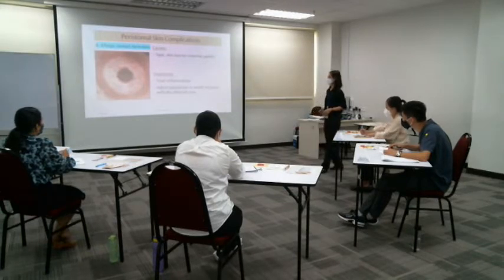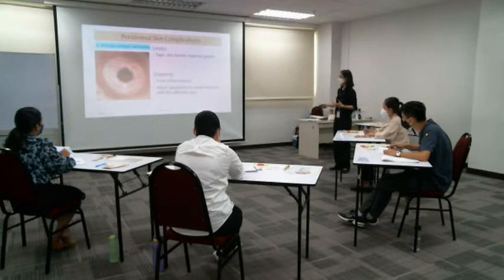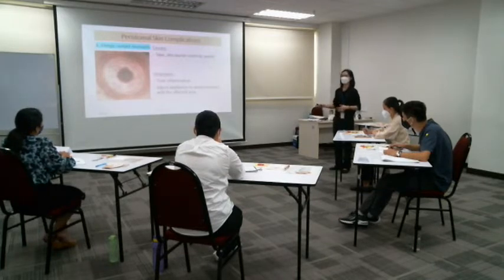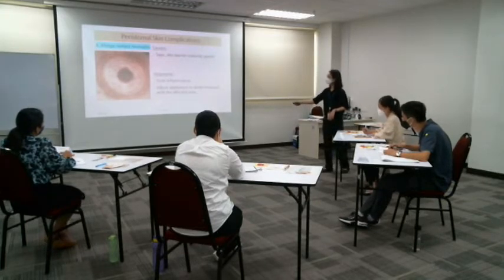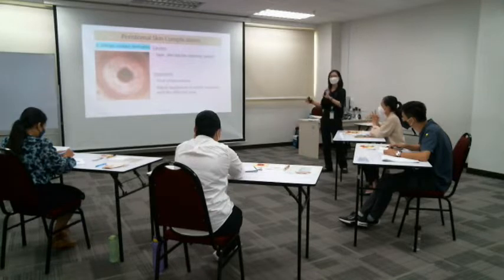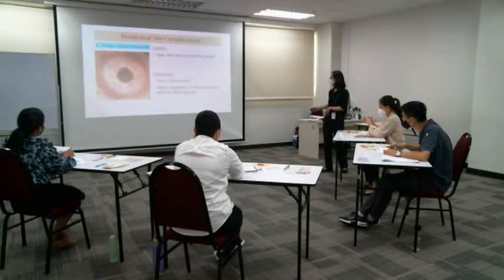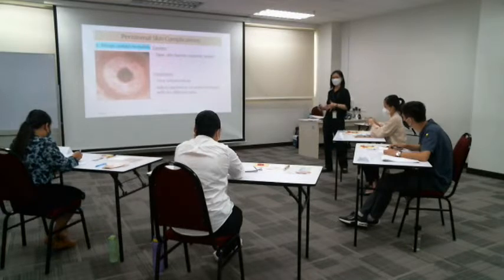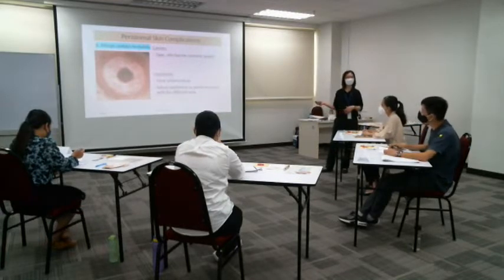Okay. So in this case, treat the inflammation first. Then after that, adjust the appliances to avoid recontact with the affected area. You know that it can be due to the tape, the pouch, or anything that comes into contact with it, right? Each individual is different. I may be okay with this brand, but not okay with another brand. So identify it. After treating my skin problem, I have to make adjustments and not use these appliances. After that, try another brand, or try another time.